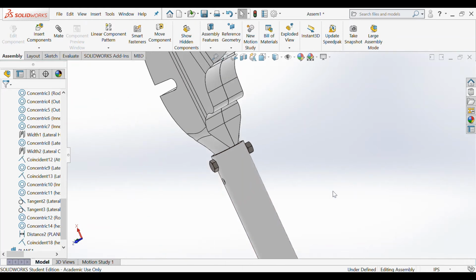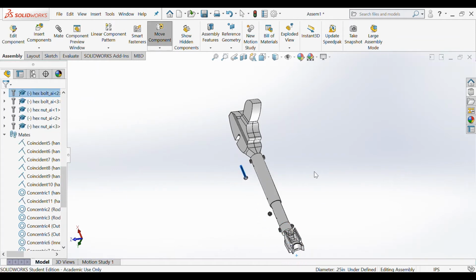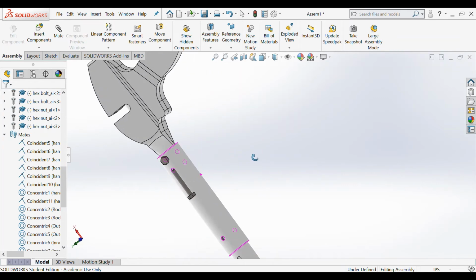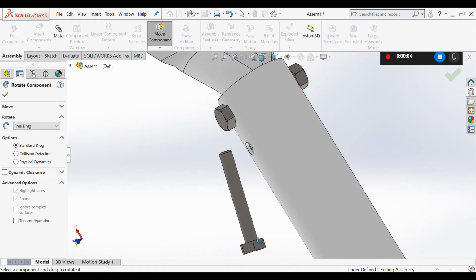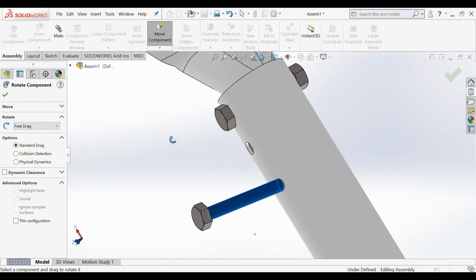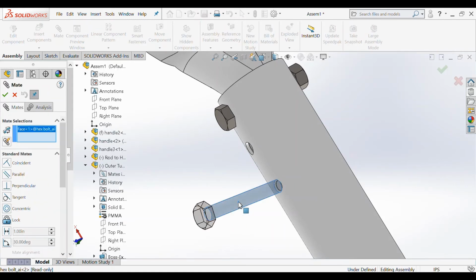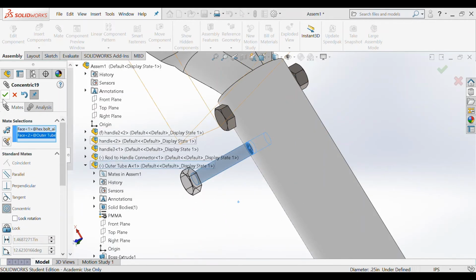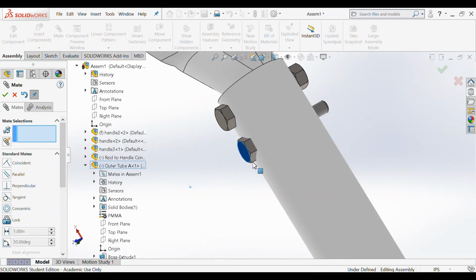Now we just have to do one more. So I'm going to go on ahead and drag the third bolt. So I'm going to rotate this component to the position that we want it to be in. And then I'm going to mate this surface to the inner hole and make them concentric. And then I'm going to move it inward where we want it to be.